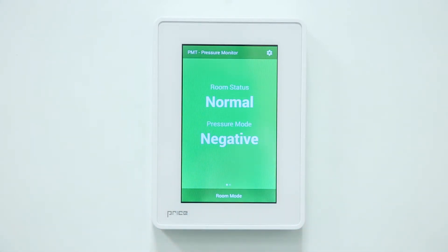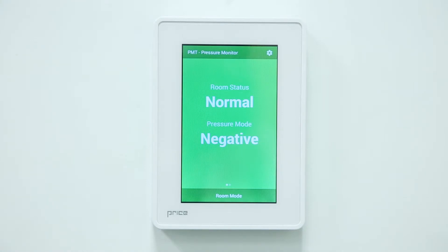When the PMT is green, the room mode is set to isolation and all set alarms are active. This is the typical room mode when the room is in use.